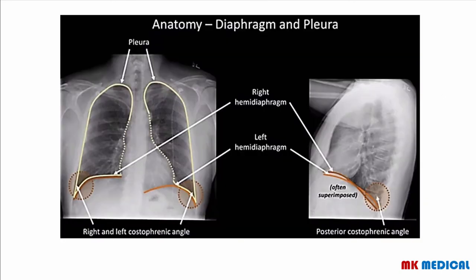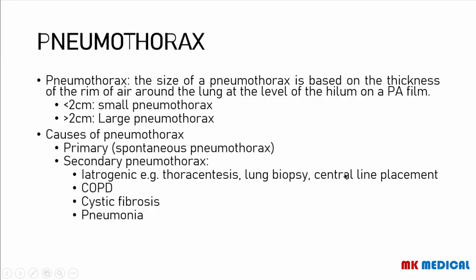Here are the costophrenic angles — they are supposed to be acute and should be present. You also have the posterior costophrenic angle that you should check for. Sometimes there may be obliteration of this angle, for example if there's fluid accumulating within the space. You can see the right diaphragm, which is much higher due to the presence of the liver, and the left diaphragm, which is lower.